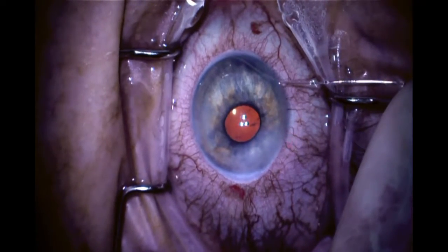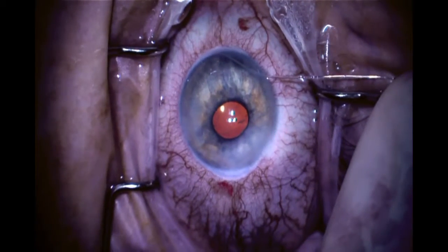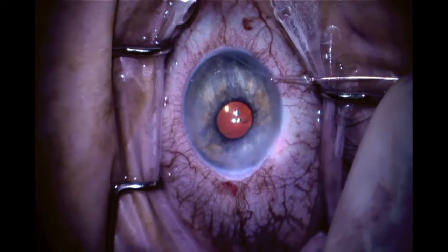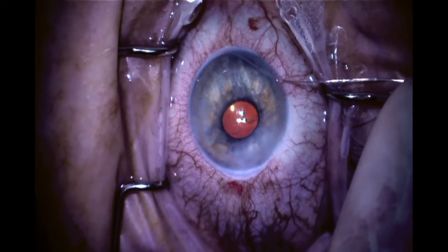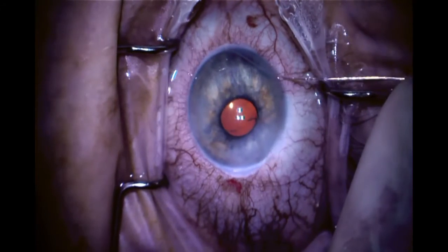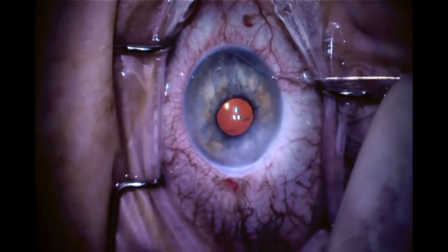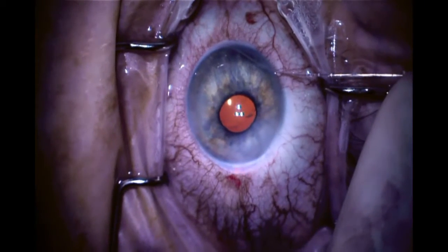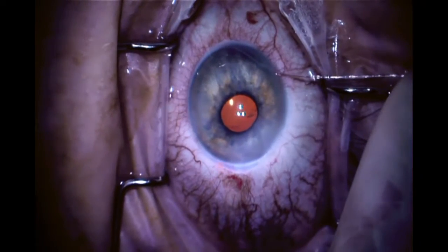There you can see there's a marked blanching of the episcleral vessels, which is indicative of a patent collector channel network and is thought to be a good prognostic indicator of success for canal-based procedures. We continue to go around, and you can see that the episcleral vessels around the limbus continue to blanch as we go around.